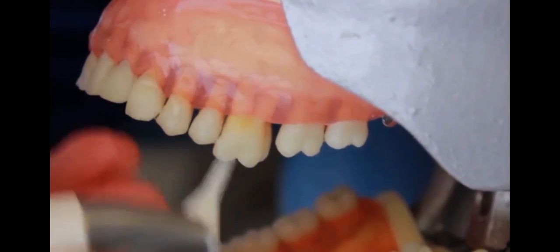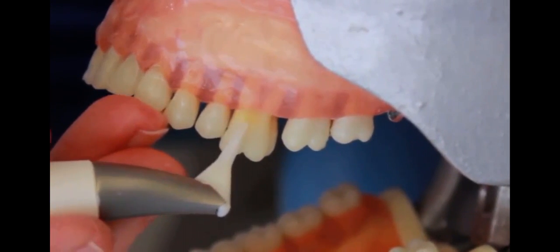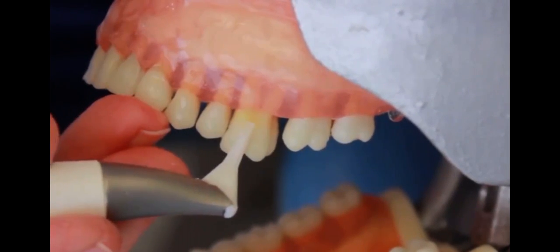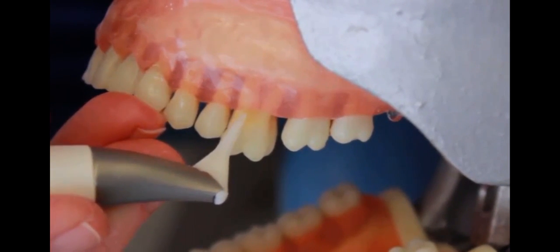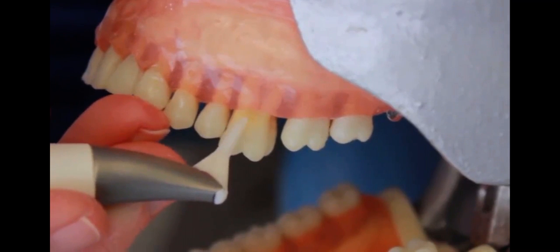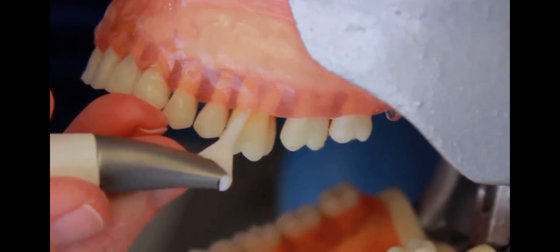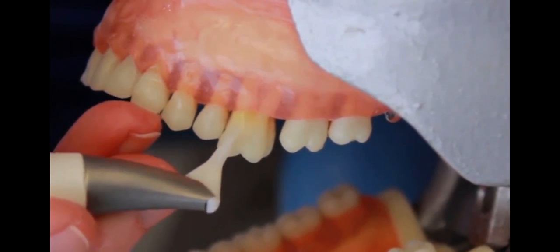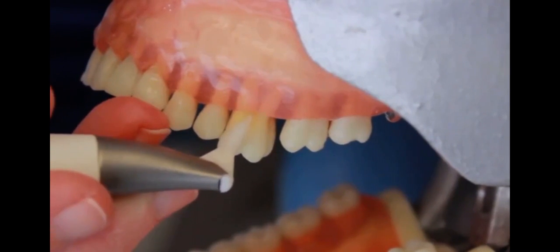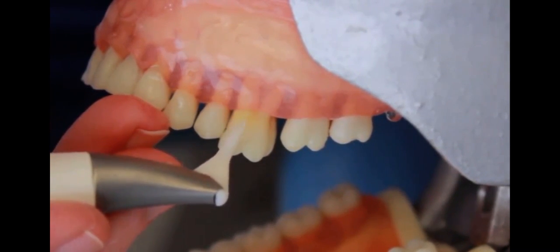One nice thing to know is that unlike the sodium bicarbonate in your supragingival air polishing, you can use this on all restorations. You can use it on the titanium of your implants and also on the cementum and dentin of the tooth. It's so low-abrasive that you can use it on all those surfaces and restorations. That's an added plus to this subgingival air polish.